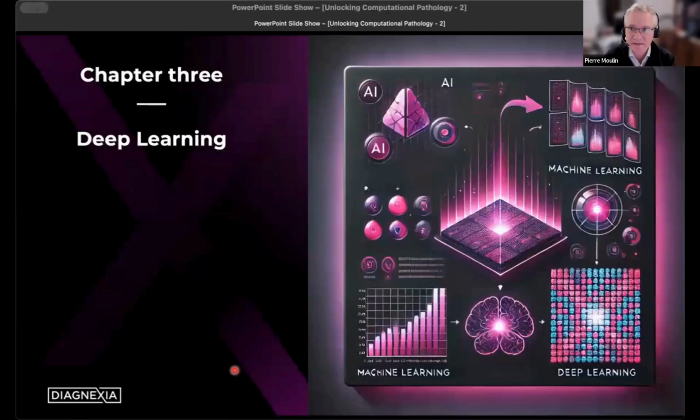Okay, so I see we've taken a bit of time on the image analysis. Let's talk about deep learning. The big revolution that arose in 2016, 2017, is that at that point, we had tools that saved us from imagining how we want to process the image and what quantities we need to measure in an image in order to extract meaningful information.